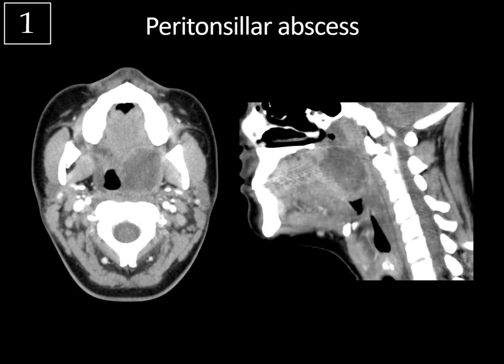This is a complication of tonsillitis with abscess formation in the peritonsillar space. It's actually usually located superior to the tonsil, between the tonsillar capsule and the superior pharyngeal constrictor muscle. You want to look for associated complications like mass effect against the airway and extension into other spaces, where you can get a retropharyngeal abscess — which we do not have here. You can also get complications of septic thrombophlebitis, with infected clot within the internal jugular vein.